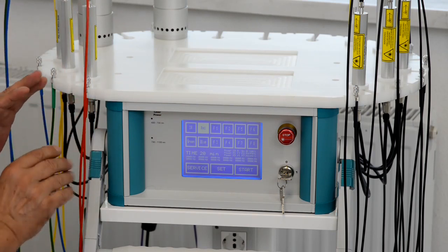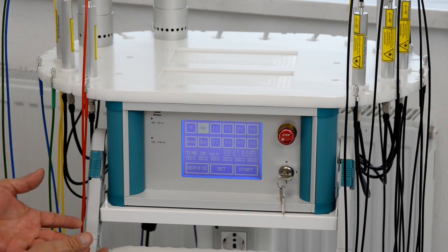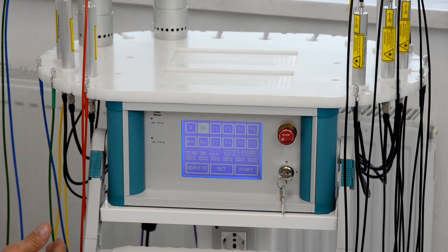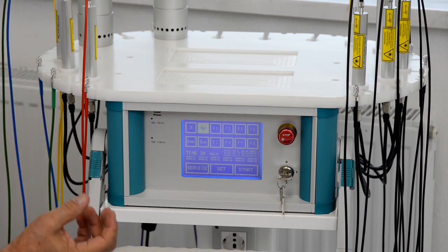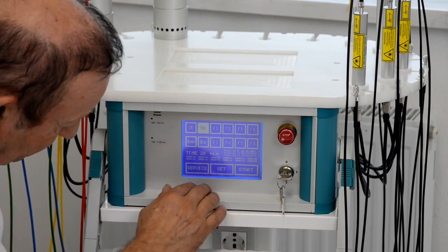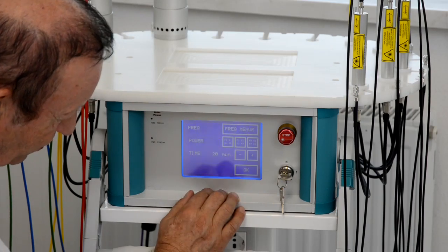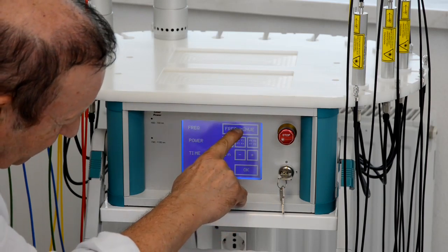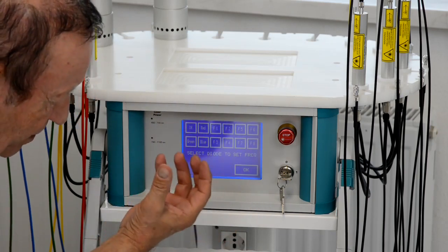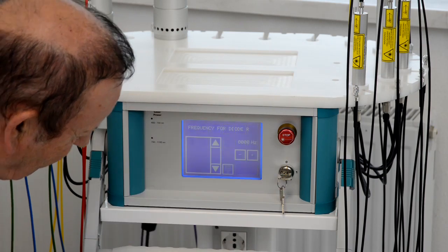It's a very nice laser beam. In this case, what I did now, the laser is running in a continuous wave mode. That means it's running all the time with the same power. Some people like to work with different frequencies. Also, I can use frequencies on this device. I'll show you how we can do this. I go to the set mode, and then I go to the frequency mode, and I want to set a specific frequency maybe on the red laser, so I press red.